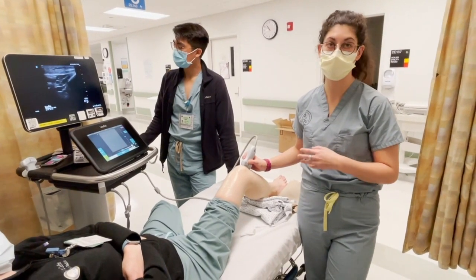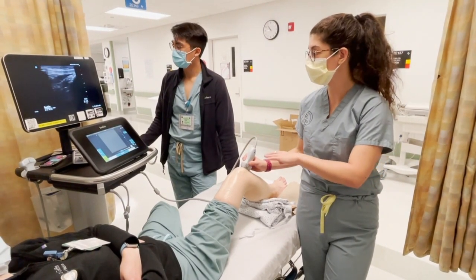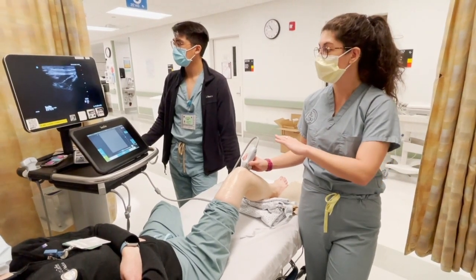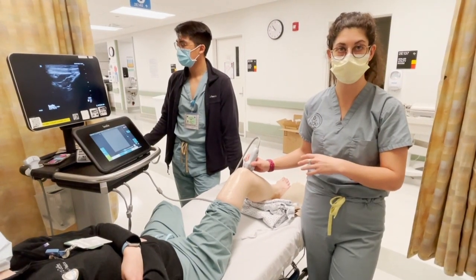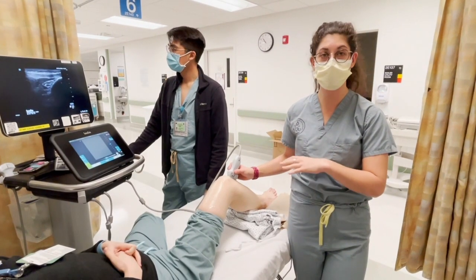This space is less sensitive for finding effusions in the joint space. If there is fluid above the tendon and bogginess on the kneecap, that's more likely to be pre-patellar bursitis. If we see fluid underneath the tendon between the patella and the tibial tuberosity, that's more likely fluid in the joint space. In the infrapatellar space, identify the patellar ligament by its long fibers attaching to the patella and tibial tuberosity, with the infrapatellar fat pad immediately below.